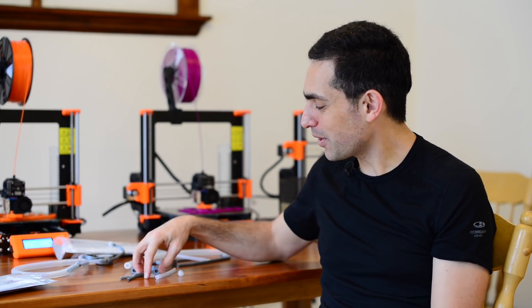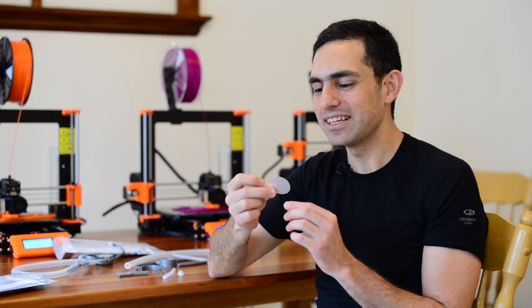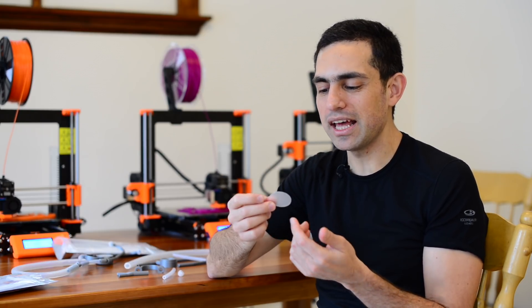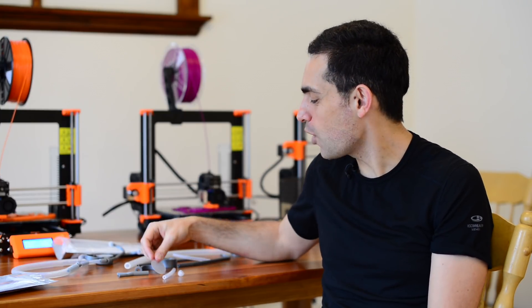And then the last part — the diaphragm comes from Duotang covers. These are the same covers you would have used on your reports when you were in grade school. We just use a hole punch, a craft punch, to punch them open.